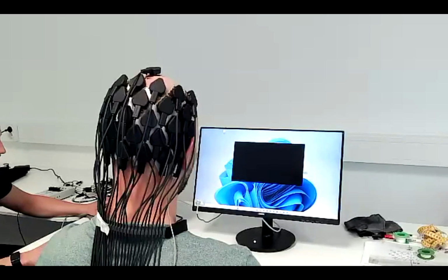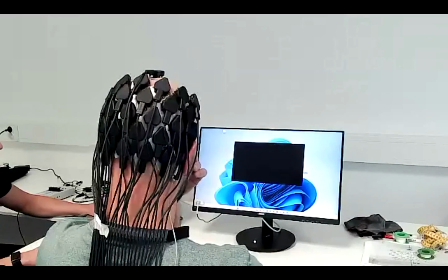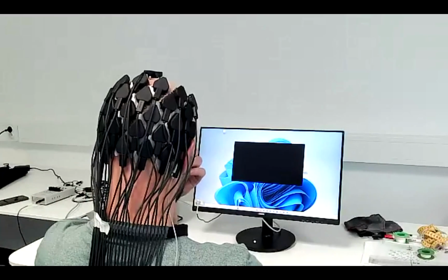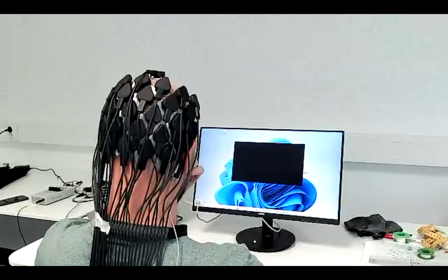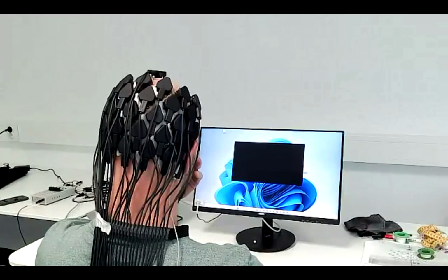Okay, yeah, that's a good one. So it's the g.PANGOLIN montage creator. There are different 3D montage plots, and we have one for the g.PANGOLIN. So there is this montage gradient, these 3D tools that we can use with the system to plot results, also online. So we have the results online and then also in our papers.